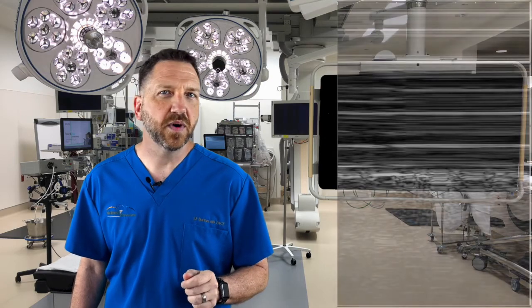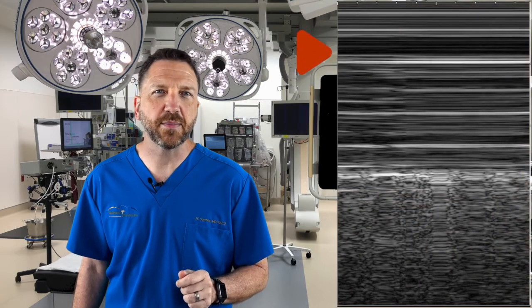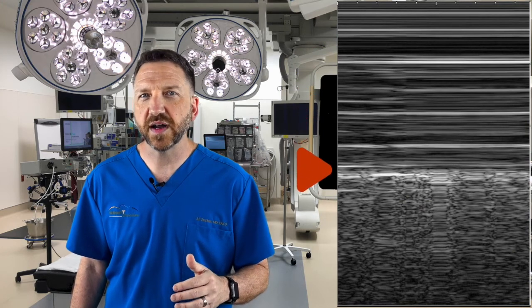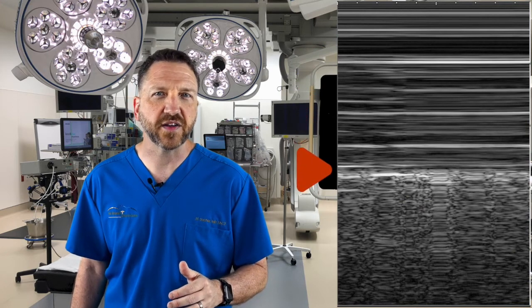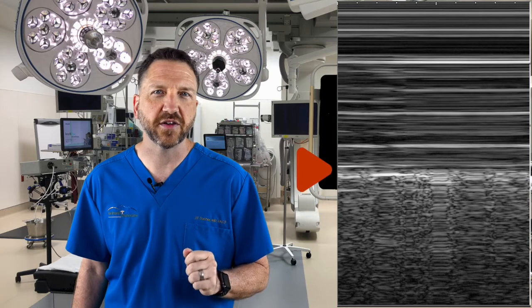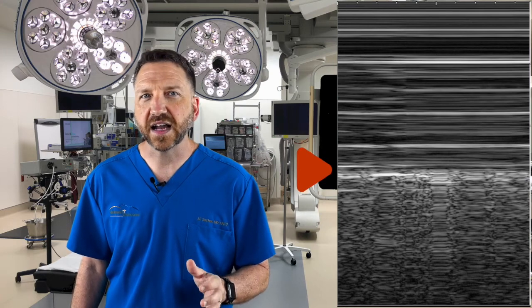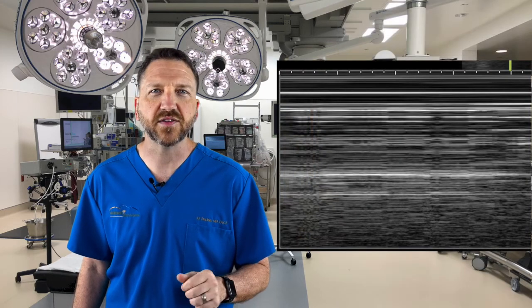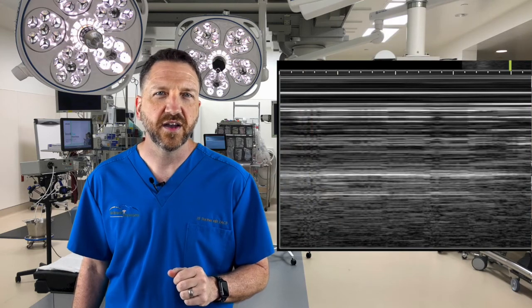In M mode, there should be horizontal bands at the top of the screen that appear like waves with a sharp transition at the level of the pleural interface to a finely granular character that appears like sand. Lack of transition with only straight bands is consistent with pneumothorax.